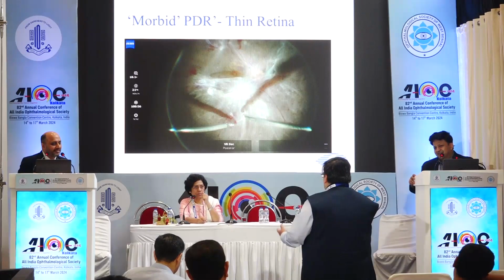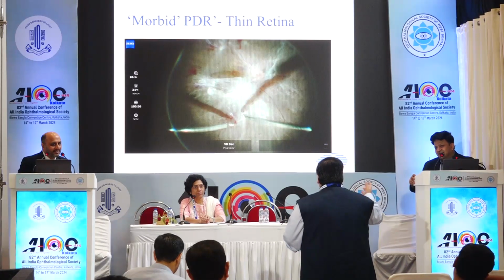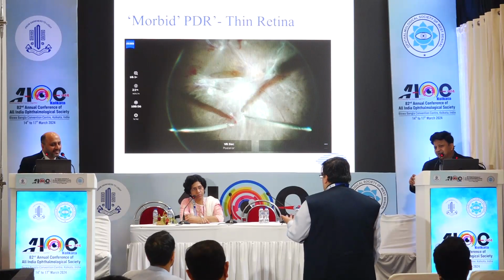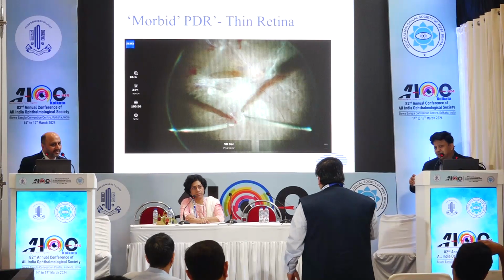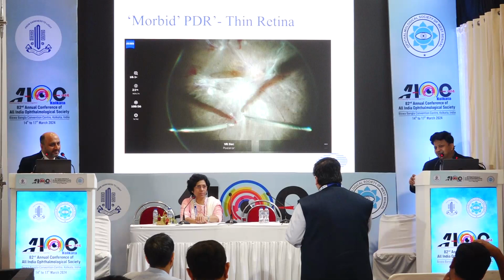Dr. Sangeet, Dr. Gagan, great surgeries first. I am a big believer in what Dr. Sangeet does. I would have mostly tackled the disc more often than not, and I generally start from the disc. Few tips: as Dr. Dhanashri was saying, if my fellow is operating, I don't let them touch the disc. The step of pulling the disc, I'll come, lift it up and give it to them.